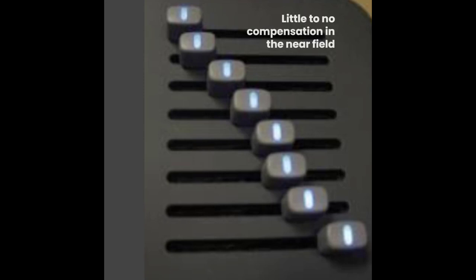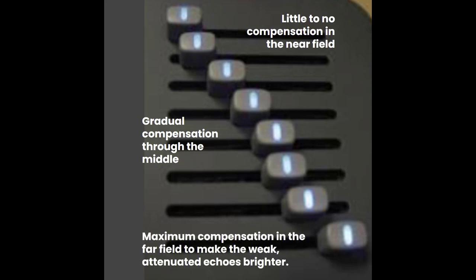In the near field, or the top sliders, we are using little to no compensation. In the midfield, then, we are gradually increasing our compensation and then maxing it out in the far field, because that's where our weakest echoes are. We wanted to make them as bright as we could to make a really even picture throughout. So again, we want to use very gradual slopes or curves to make our images uniformly bright from top to bottom.